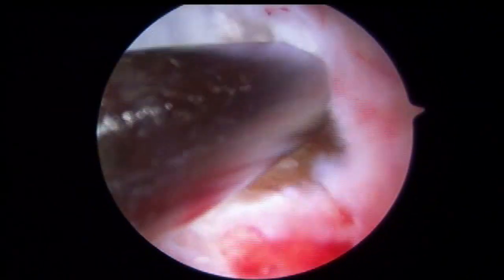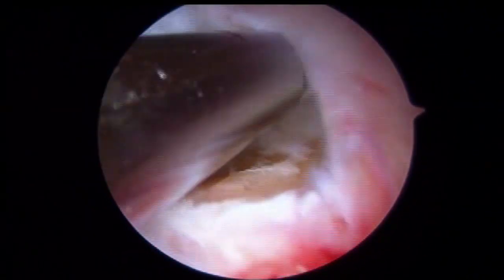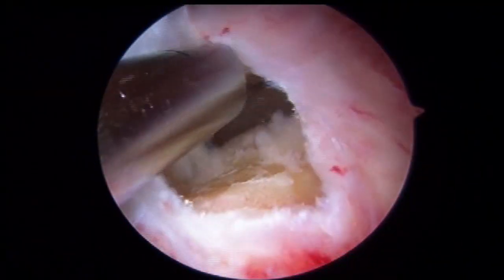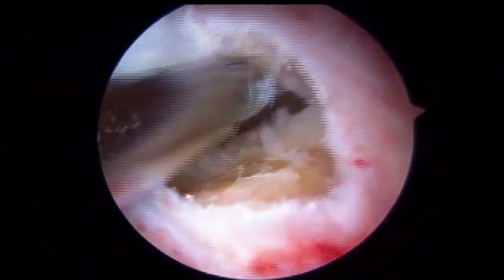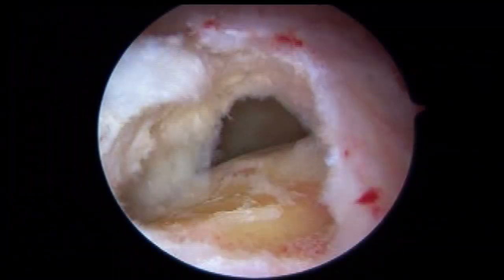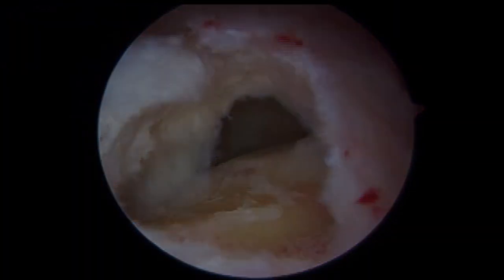Following excision, the surgeon must decide on treatment for the remaining rotator cuff. In most cases, the calcific deposits only occupy a small portion of the rotator cuff and simple debridement is adequate. However, in this case, the deposits were incorporated into the entire thickness of the supraspinatus and infraspinatus, which left a moderate-sized full-thickness tear requiring rotator cuff repair.